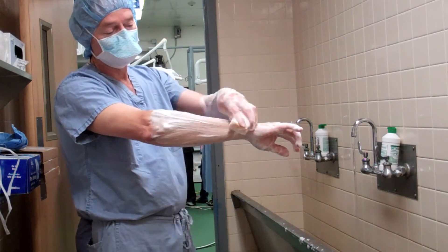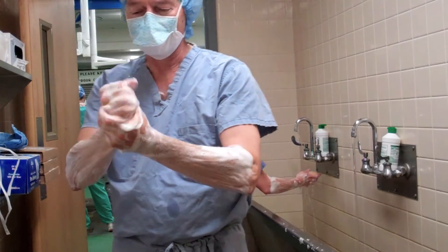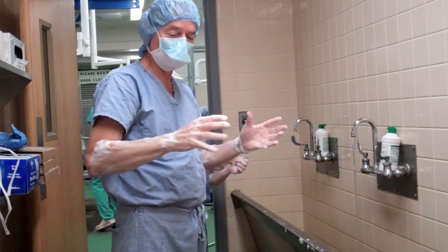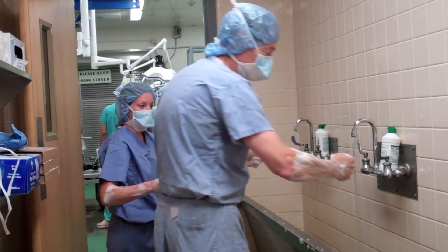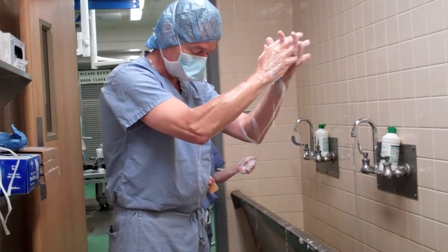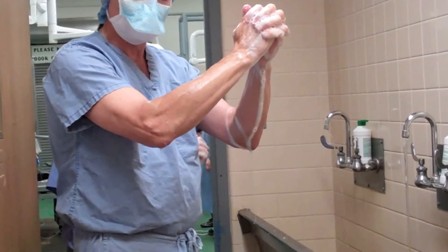It's been approximately five minutes. Remember, I had more contact time on my arms. I discard the surgical scrub brush now. Some surgeons leave the residual soap on; I do sort of a half rinse, so I have residual soap remaining on my hands. Notice how I'm letting the water drip from my hands down to my elbow — maintaining that gradient during the rinse as well.